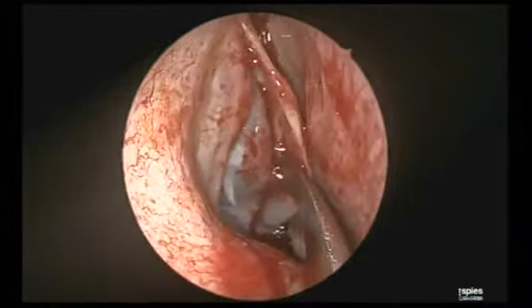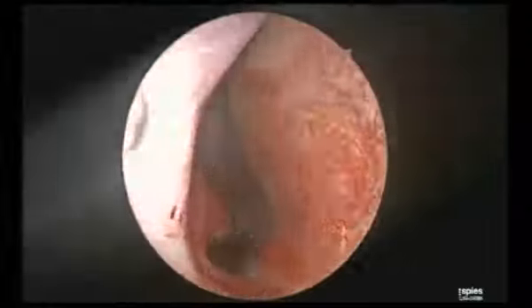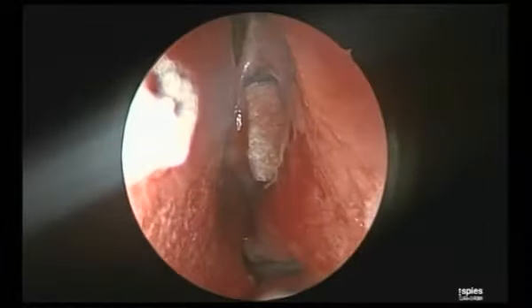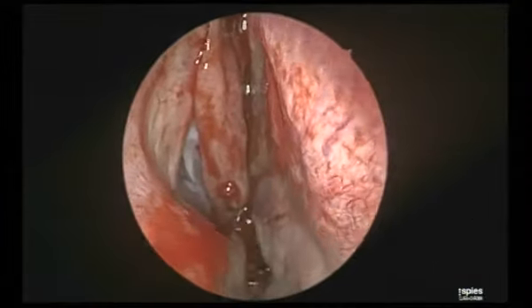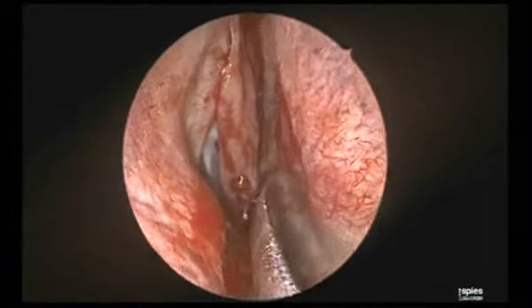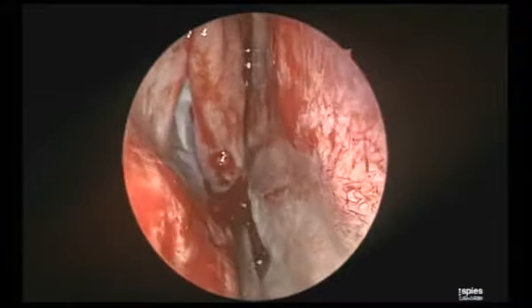Another important thing is nasal absorption of adrenaline, if you use frank adrenaline topical. Besides this, I mentioned in the beginning, in over 90% of situations, we have to do something with the nasal septum or the turbinate for the access. But the trick is: apply, don't press. See what I have done? Out-fracturing the inferior turbinate, see the access we get.